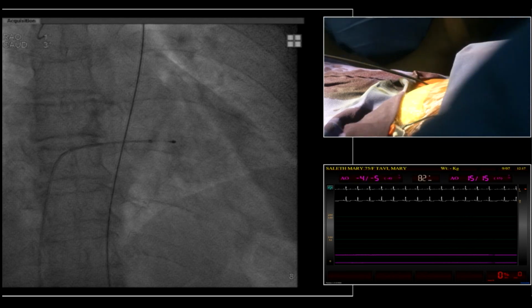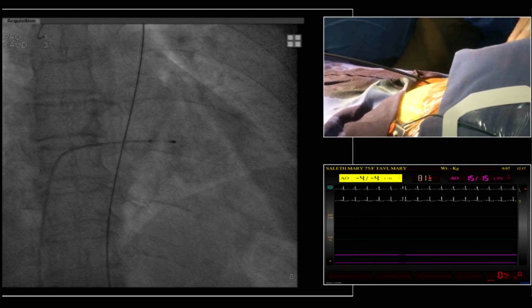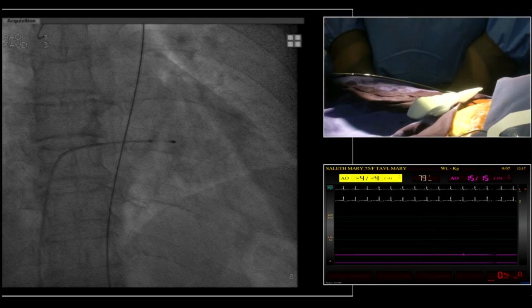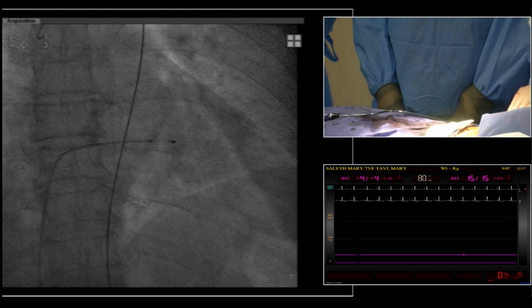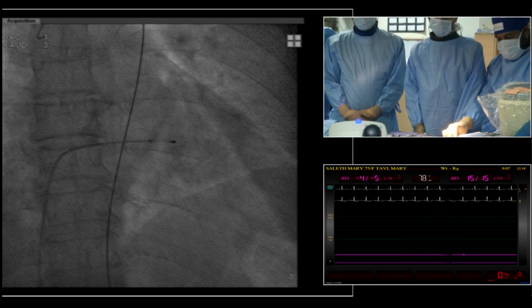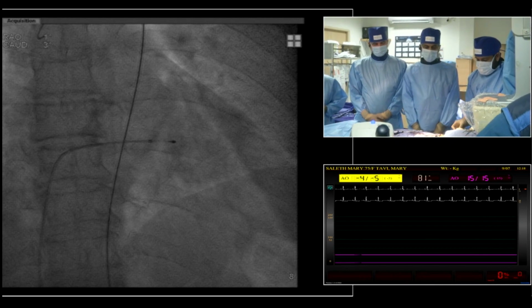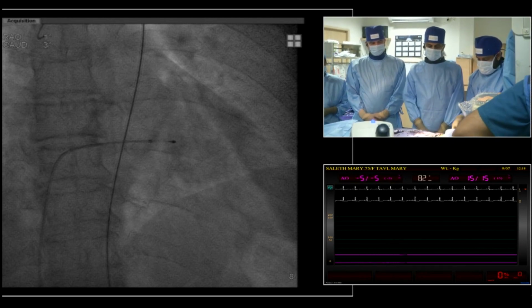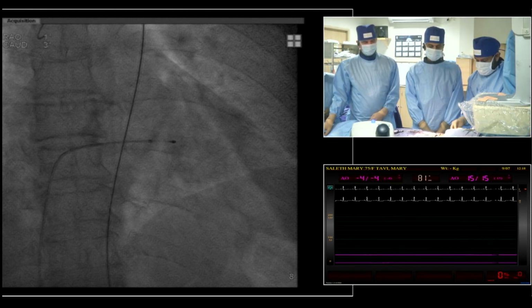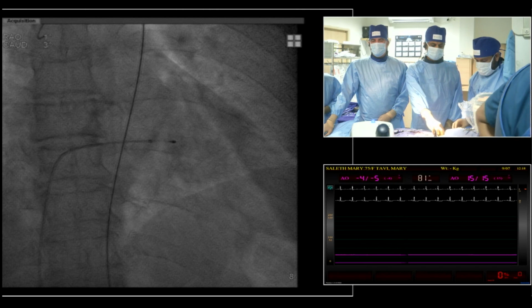Yeah, you can see on this screen that you can, in the long axis, see clearly the bifurcation, and then you just have to turn the probe 90 degrees in order to do the puncture in the center, because these are the two rules. One is to be above the bifurcation, but the puncture in the center is a guarantee of a good result when you do the closing. If you do a lateral puncture, it will not be good. So this is very important, and this is exactly what they have done during our discussion. So maybe, Kentaro, you have some recommendation about that, you have experience.